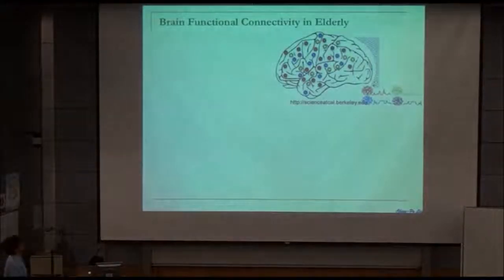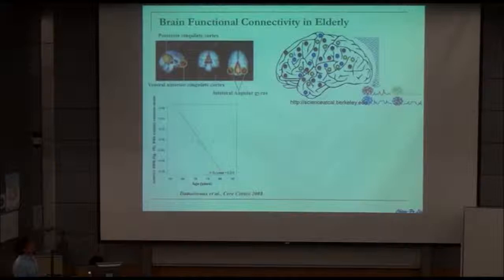And the last one is something people use more recently to detect brain function: studying functional connectivity. What does that mean? For brain activity, there are similar patterns in the brain. For example, in this red region and this red region, they have quite similar brain patterns, so we can claim that they have some functional connectivity. People use this way to detect functional connectivity changes following age. You can also see that for the young population, such links are stronger than in elderly.